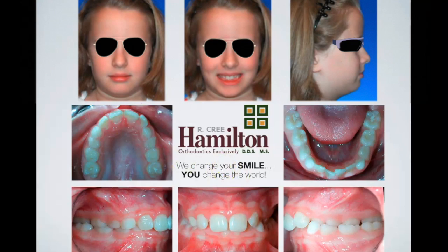So from a dental standpoint, pretty much the same argument can be made here, although I would say we have a little less ability to procline these lower incisors than the upper incisors. But you'll have some proclination there as well. So from a dental standpoint, as far as impacted teeth, root resorption, having to pull permanent teeth, we can't really justify the expansion there. So we talked about justifying the expansion based on preventing unwanted growth of the mandible, having that lower jaw move over to one side or the other. Nobody wants that. What other reasons can we justify expansion in this case?